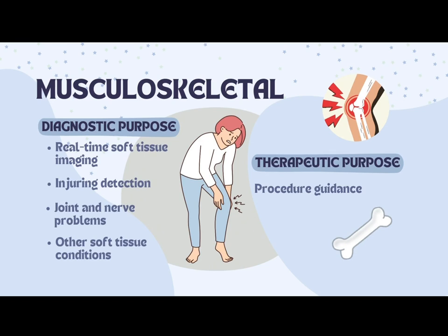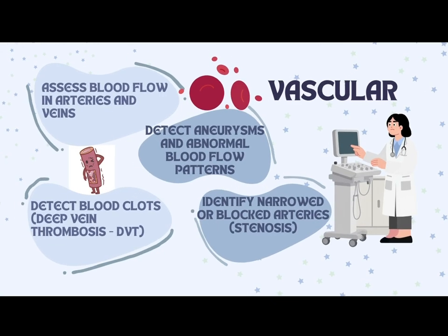It can also identify bursitis and soft tissue lumps, including tumors, cysts, or bruises. On the therapeutic side, it helps doctors perform procedures more accurately, such as injections, fluid aspiration, and biopsies, by allowing doctors to see the targeted area in real time.